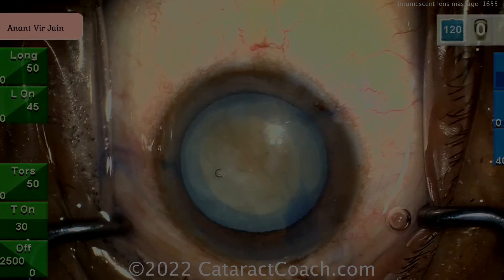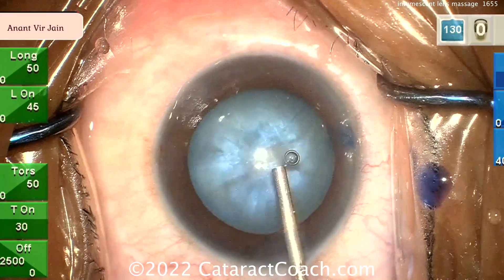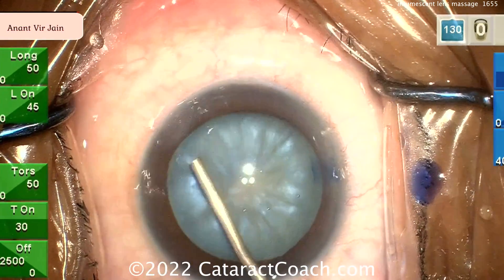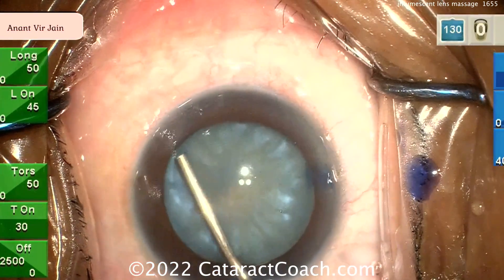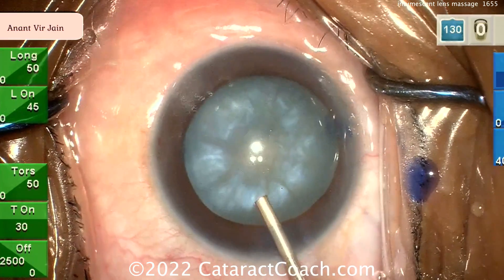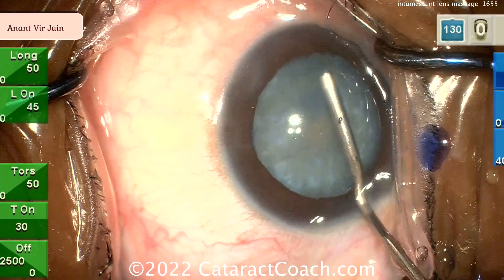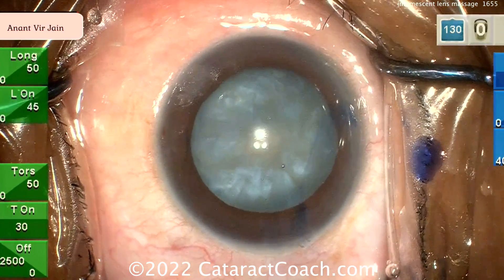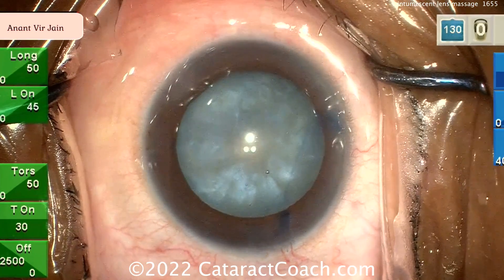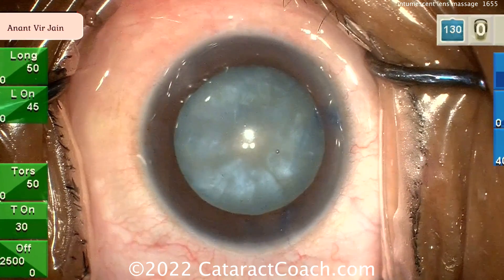Here's another one — you can see the clefts. Going inside here, there's loculated fluid. Pushing that around — you can definitely see fluid there. You've pushed it away from the center and now the center is flattened out — smart move. This is essentially pushing fluid from the center of the anterior subcapsular space to the peripheral or equatorial space. You still may want to do a needle decompression in these cases, even though you do this massage.